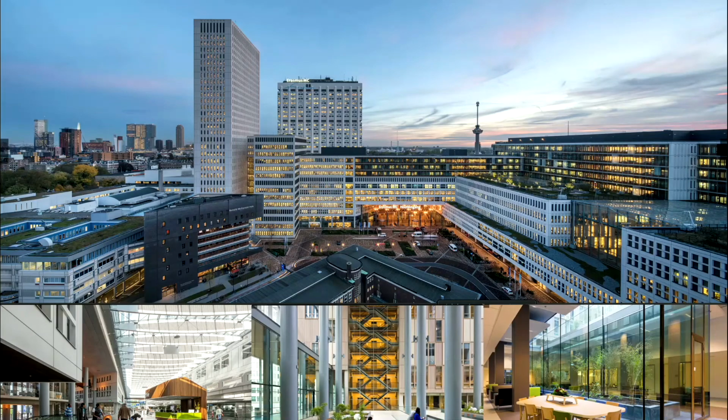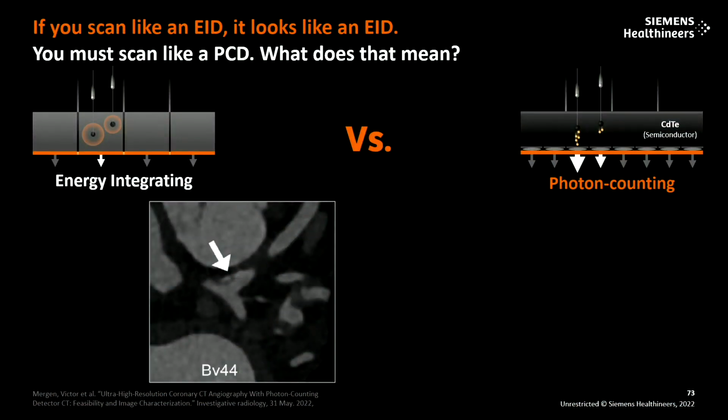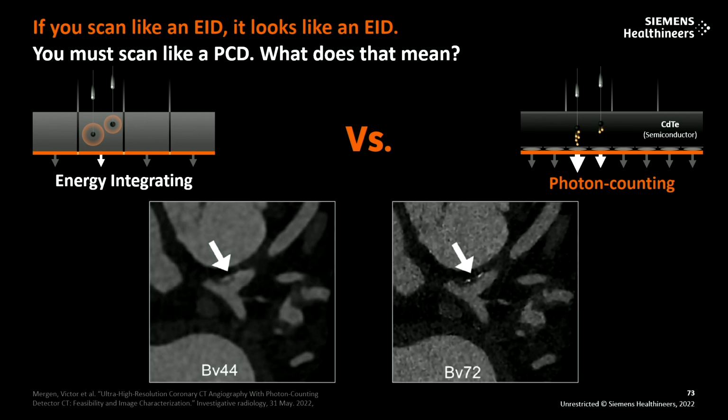Wonderful as well. I just wanted to end with 2 or 3 slides before we open it up to questions, because it's an important consideration. This is a completely new level of detector technology. We can't treat it like it's a conventional energy integrating system. The thing that we talk about first with our customers who are joining us on this journey and installing this: you can't treat it like it's a conventional system. You have to move past it, because you get drastically different levels of quality. You can't just copy your protocols from one system and move it over.